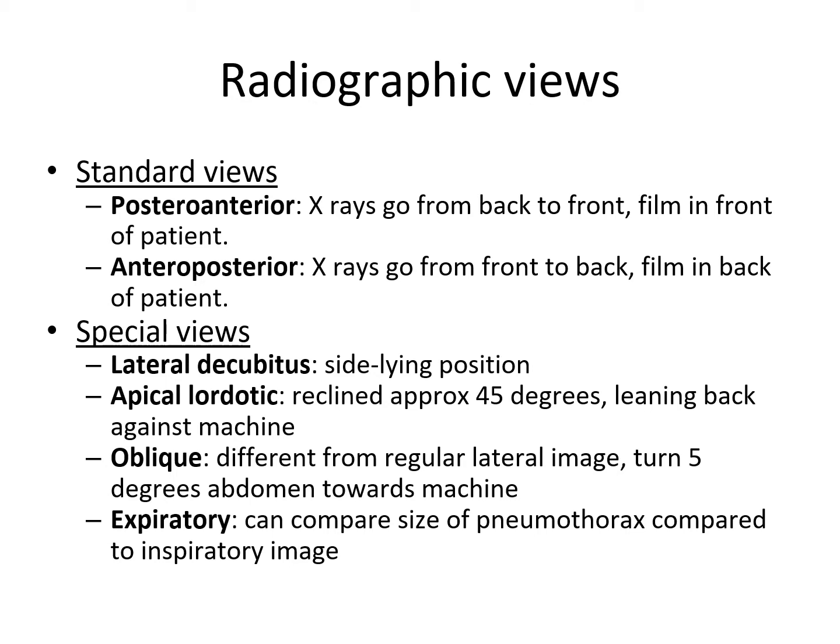Ideally, as we saw in that first little picture, if they can go down to radiology and have the x-ray done, generally the distance between the film and the x-ray source is about 6 feet. But a lot of times we see them do these portable x-rays, and then they're about 4 feet in distance. So the physician orders what type of view he wants, depending on what they're looking for.